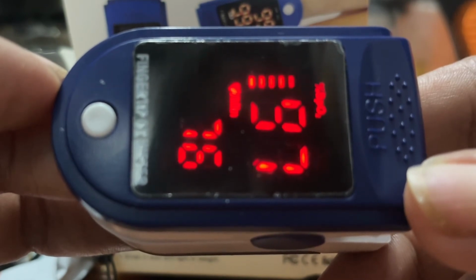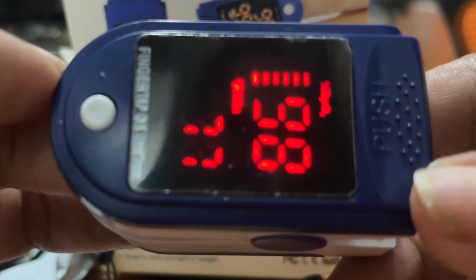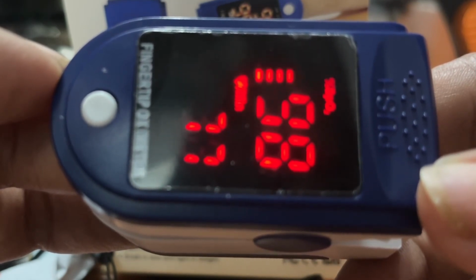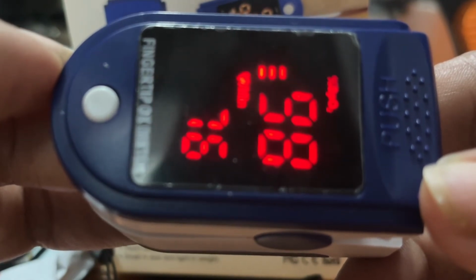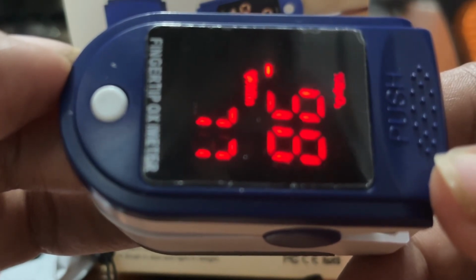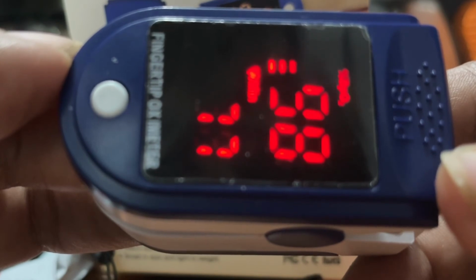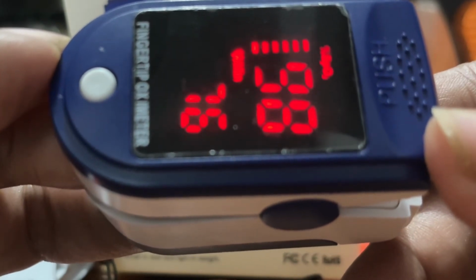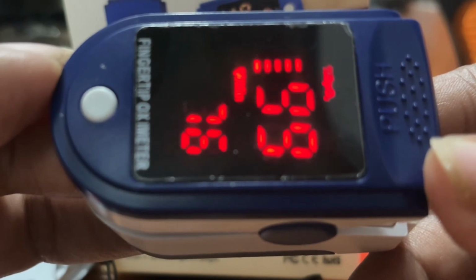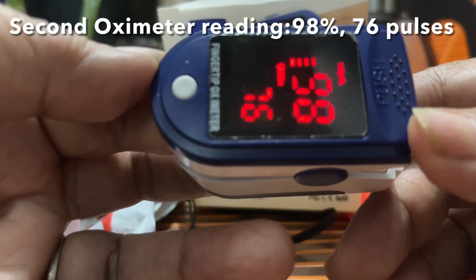What are the benefits of pulse oximetry? Pulse oximeters are useful for people who have conditions that affect blood oxygen levels. Pulse oximetry can help monitor oxygen saturation over time, alert to dangerously low oxygen levels, particularly in newborns, offer peace of mind to people with chronic respiratory or cardiovascular conditions, assess the need for supplemental oxygen, monitor oxygen saturation levels in people under anesthesia, indicate dangerous side effects in people taking drugs that affect breathing or oxygen saturation, and determine the effectiveness of breathing interventions such as oxygen therapy and ventilators. This is the one that's used for COVID patients.